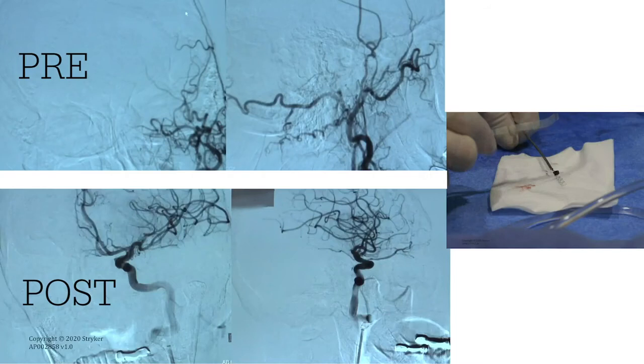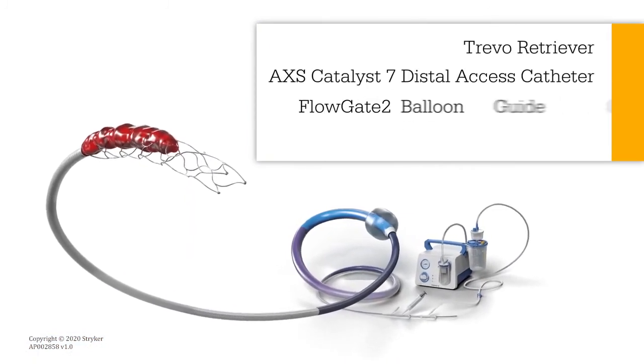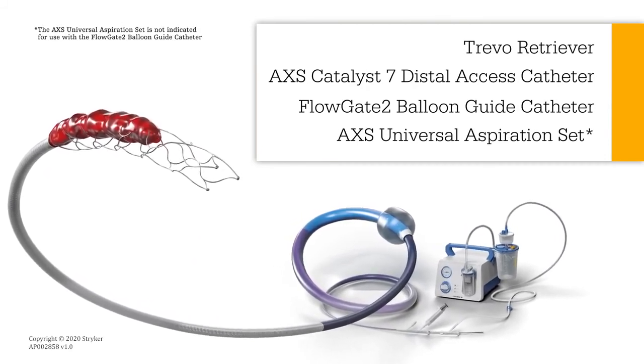I hope these highlights help to better understand the different components of this technique, and this case illustrates very well how, after standardizing and coordinating your team, you can have this done in a very efficient way and achieve more often a first pass total TICI 3 recanalization.